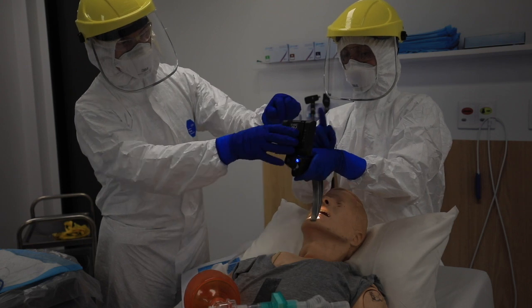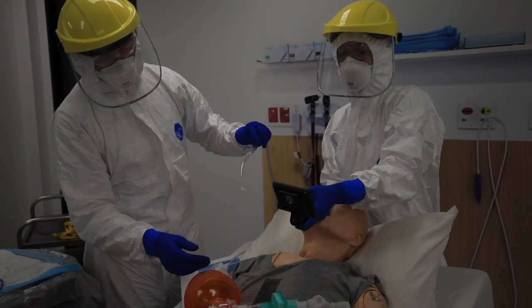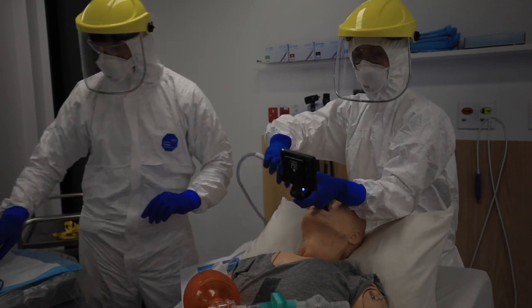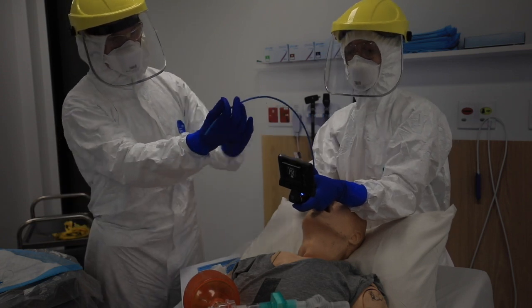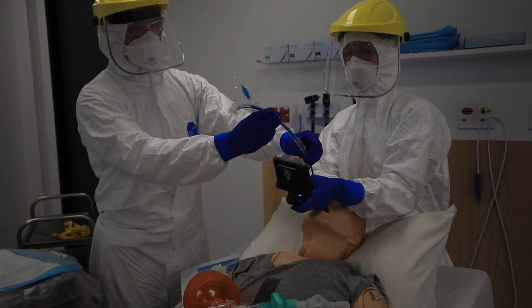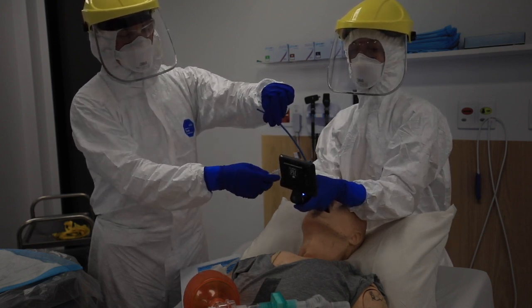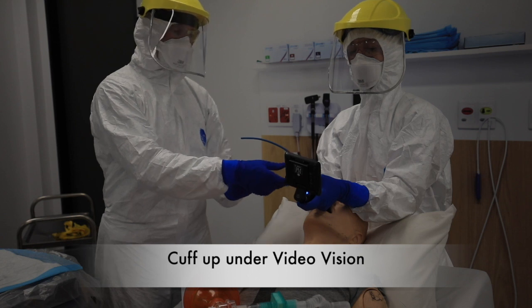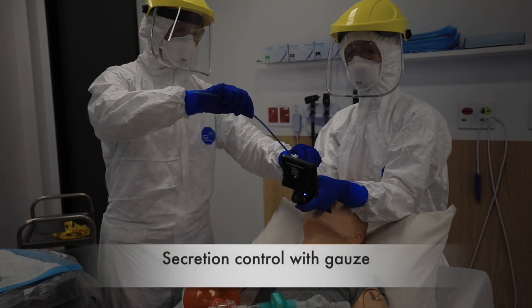Confirm screen angle — adjusting slightly. Suction required — good view of the cords, just some secretions. Suction applied. Bougie please — bougie through the cords. Loading the tube — tube over the bougie, tube through the cords. Happy — about 22 at the teeth. Inflating cuff. Cuff up, no herniation. Gauze in hand — bougie out and away.